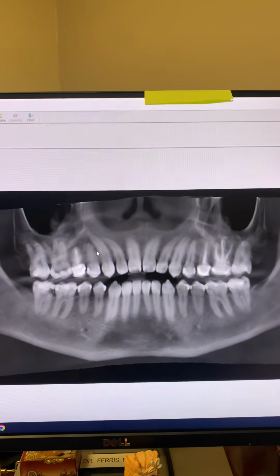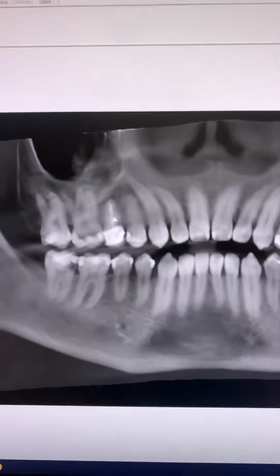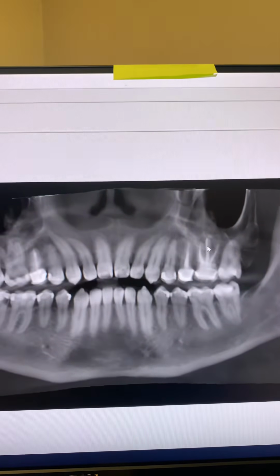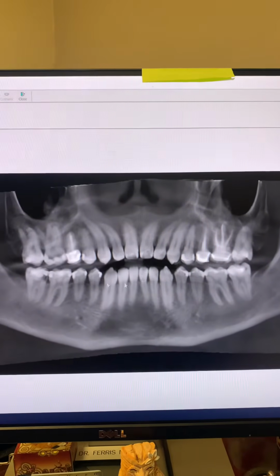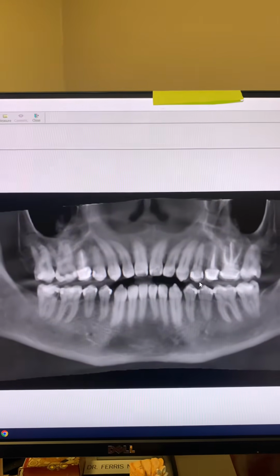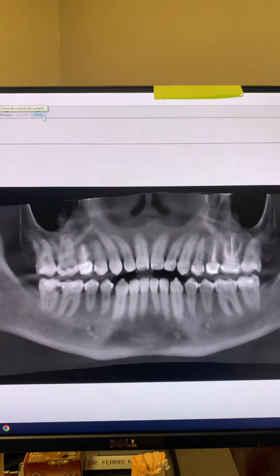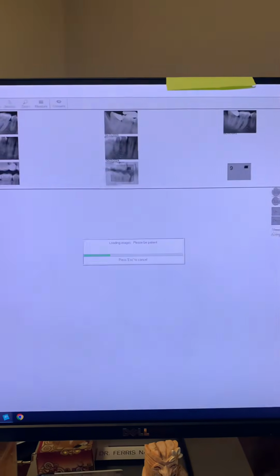All right, so now let's look at these teeth. Let's look at tooth number 4. As you can see, it's really inconclusive. Number 13, inconclusive. 14, maybe, maybe not. There's a periapical radiolucency. So these are the things that you cannot really pick up on a panoramic radiograph, and you need to take PAs for endodontic reasons. All right, so we sedated this patient and went ahead and took a full mouth radiograph. Now take a look.